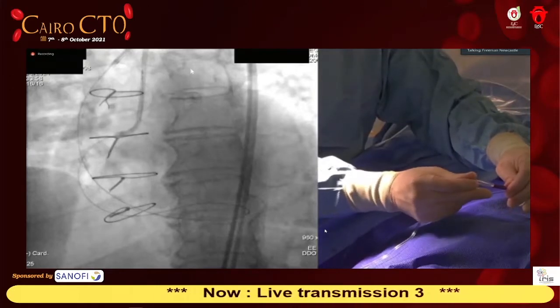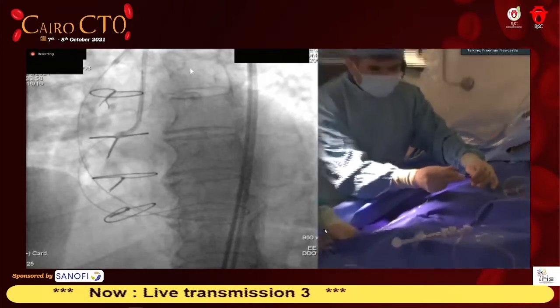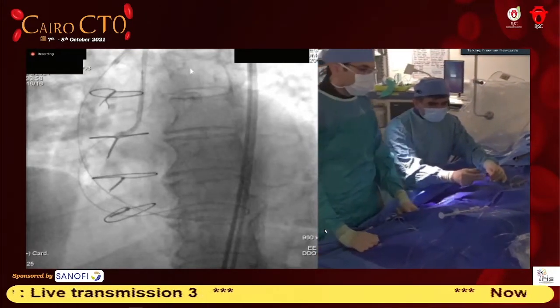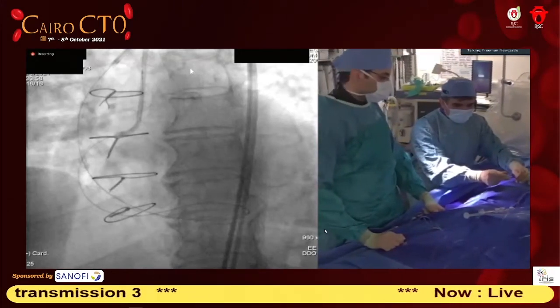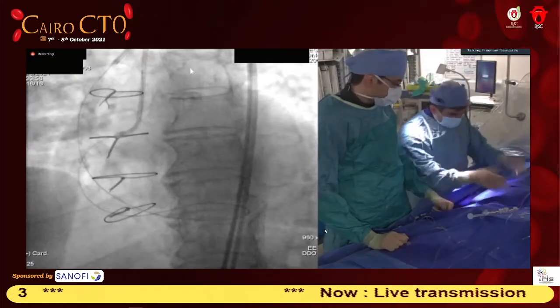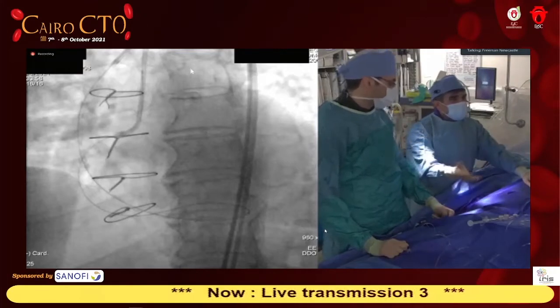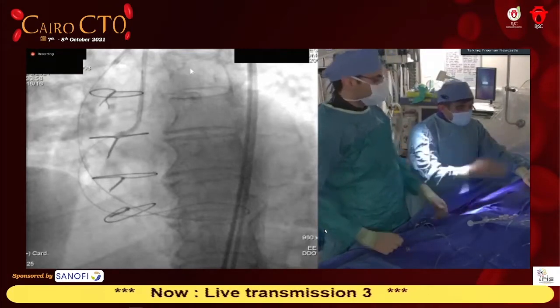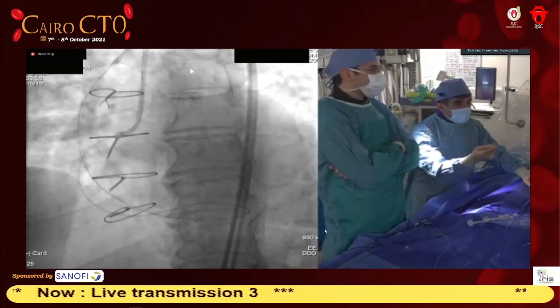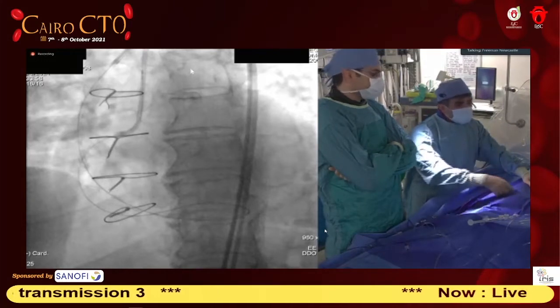However, often for me, I could move the camera back to me here. Because now I have a microcatheter antegrade, the worry about having a retrograde wire is, of course, the thrombosis or the native artery dissection or any of these problems. Of course, in a vein graft it is not a major deal. But if you're going through the left system, for instance, to do the right, once you've achieved the antegrade or the retrograde externalization, you could take your antegrade microcatheter and pass it through on top of the wire, and then it becomes a normal antegrade procedure.